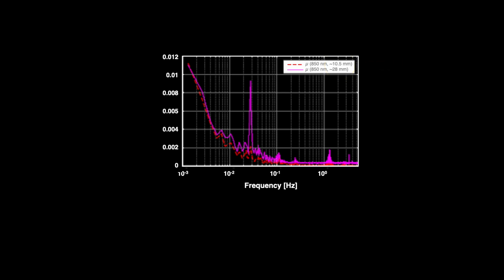2 spectral peaks are notable, which are particularly prominent in the medium distance measurements. The larger peak reflects regular presentation of the stimulus in this task-based example. This signal is generally not useful as a QA metric as it is strongly dependent on the experimental protocol. For example, it would not appear in resting state data.